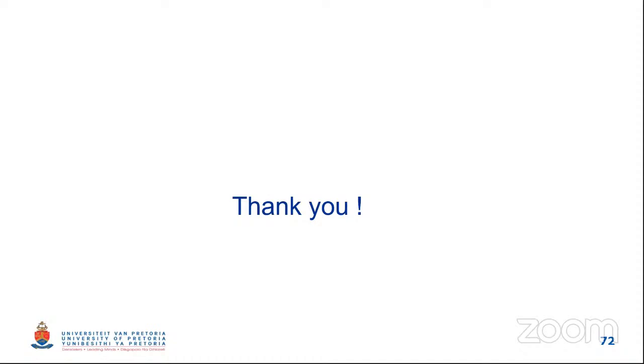Dr. Sharon Naidu: Hi, Andre. Thank you for the lovely talk. Does a Panorex X-ray still remain your first go-to image? Hello, Shane. Yes, it's still a nice radiograph for an overall view. So yes, for a first line, I would still do a panoramic radiograph. If there's something that you know is not going to be in the image, like the anterior region, where a panoramic radiograph is not always great, and with your clinical diagnosis you think you're not going to see it on a periapical, I would consider a CBCT. But otherwise, for overall impression, I would still do a panoramic radiograph as my first radiograph.